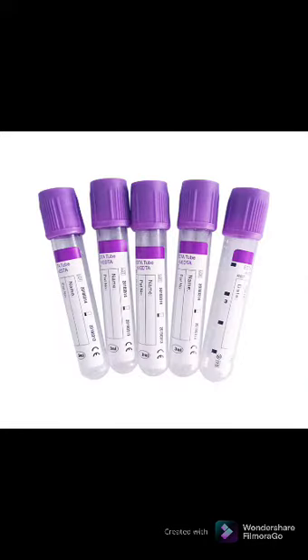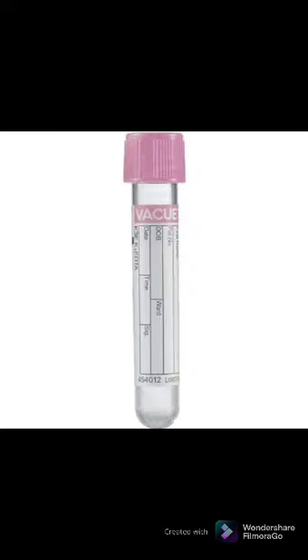We have the lavender top tube, or the purple top tube as we would call it, and that has the EDTA additive. The function of the EDTA prevents clotting by binding calcium, and that is found in the hematology department. Then we have the pink top tube. This also contains EDTA, and the function of that also, it prevents clotting by binding calcium, and this is found in the blood bank department.